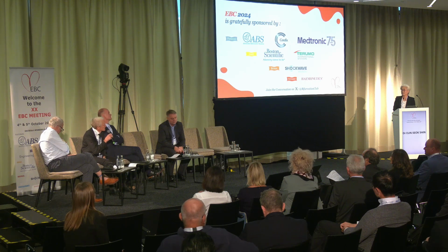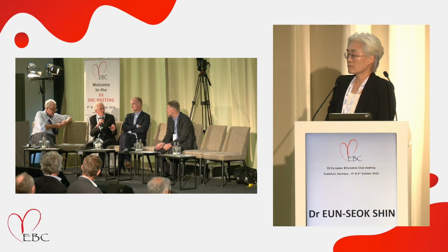I think this is very important information. About 10 years ago, our group, together with Bruno's group, published on positive remodeling. We have often discussed whether this is a vessel size increase or a plaque regression. It's probably both, but you showed definitely, with the side branch ostium increasing, that the whole vessel gets larger.